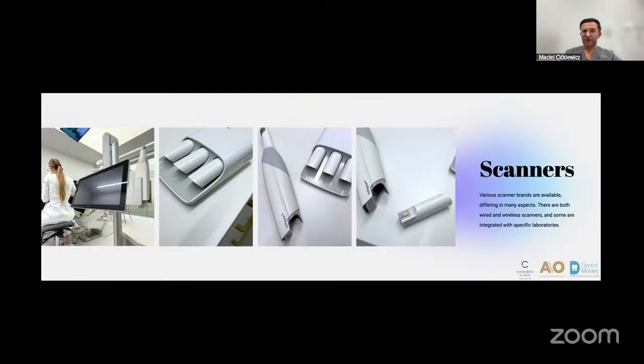And another one, of course, is that you have to juggle the batteries. It means that you have one battery, two batteries, three batteries, and sometimes your assistant should always make sure that the battery inside the scanner is working all the time, because the problem appears when the scanner turns off and you want to start scanning, so you have to change it, and then you warm up the scanner, and then other problems appear.